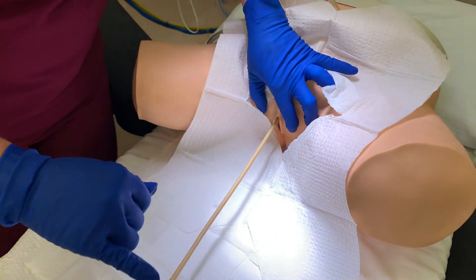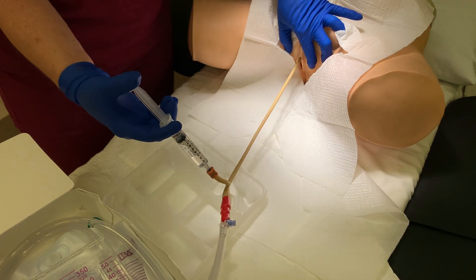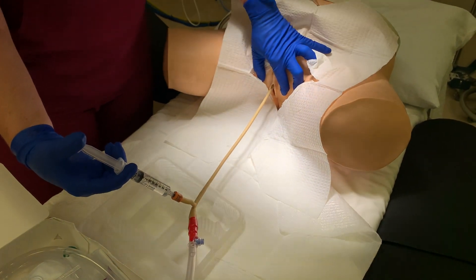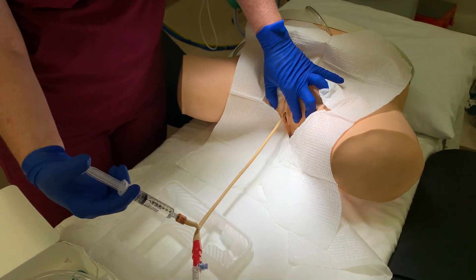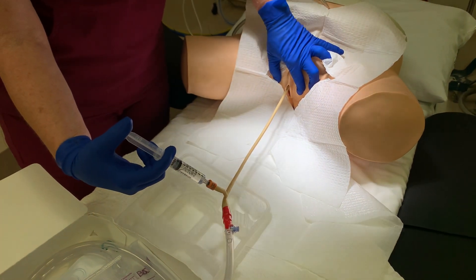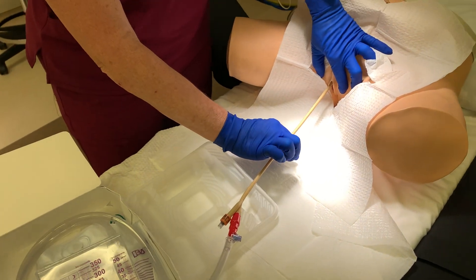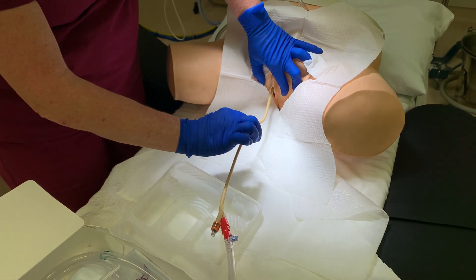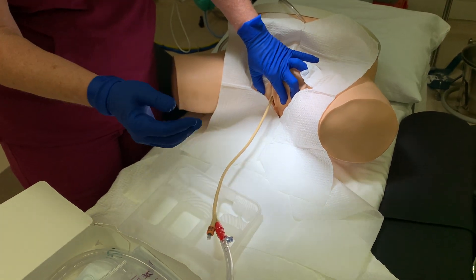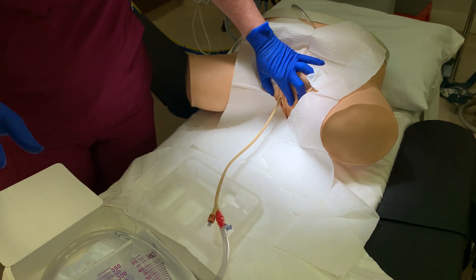I've advanced it two or three inches and I see urine. Now it is time to inflate the balloon — this is what keeps it suspended in the bladder trigone area. In these particular mannequins we are not able to fully inflate this balloon inside the bladder, but you would definitely inflate it fully, still with the same hand, then remove the syringe and gently tug back on the catheter, making sure that it is staying in the bladder. At this point, the catheter is sufficiently placed — we're seeing urine and it's suspended there because of the inflated balloon.